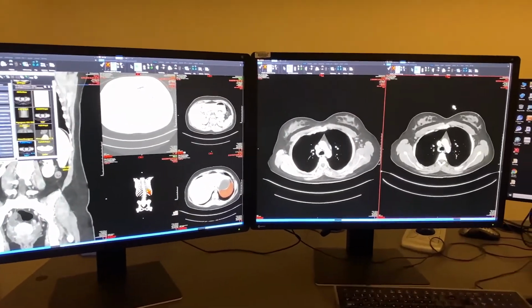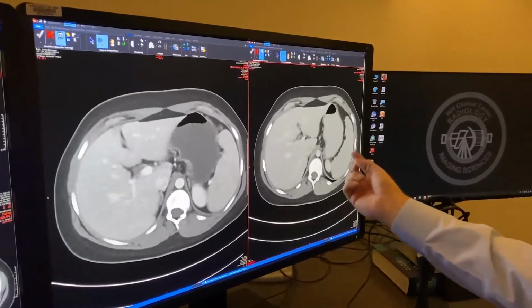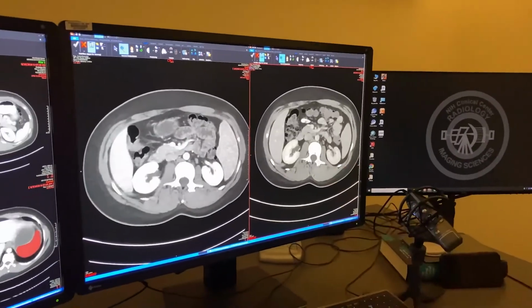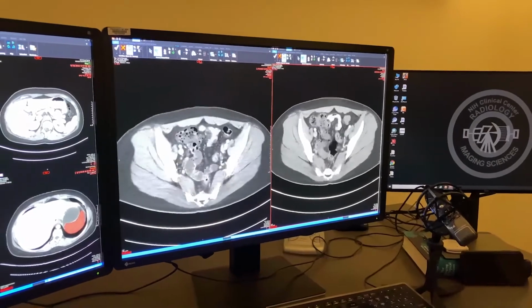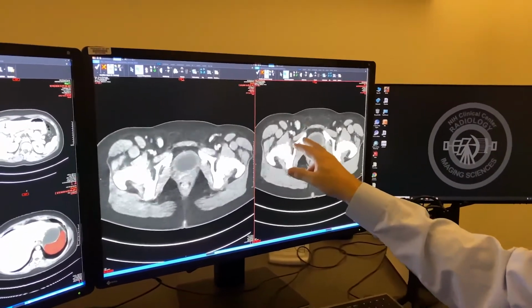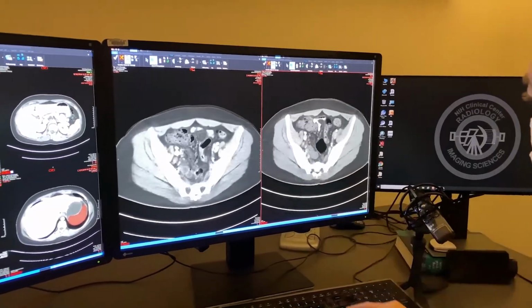But now we're on soft, and we're looking at, so we left off in the spleen. Notice that's enlarged. We finished with the pancreas. We're looking at aortas where I left off, and here's the vena cava. So vena cava and aorta, looking for any vascular abnormalities. And then I pick one side and I keep following that all the way down. I'm seeing the adenopathy over here. I'm disregarding that because I'm right now on the vessels. That's just a flow artifact right there.